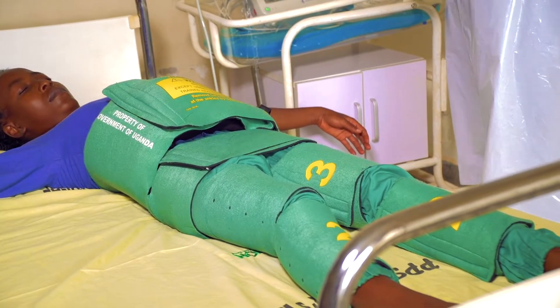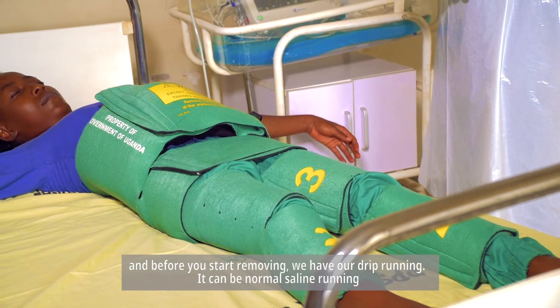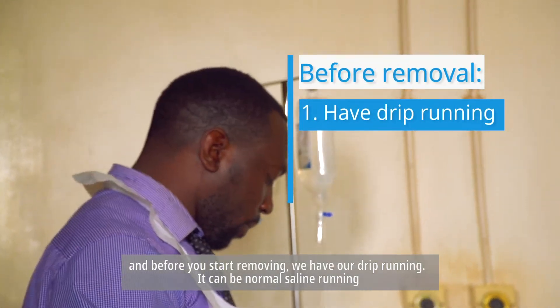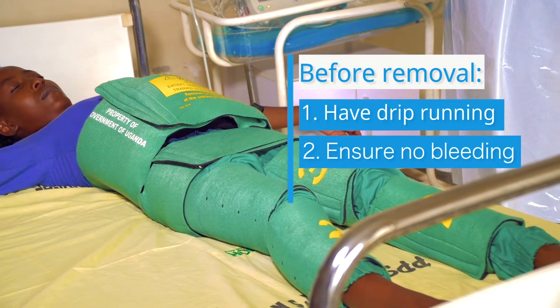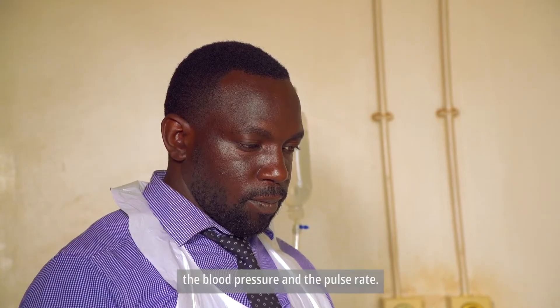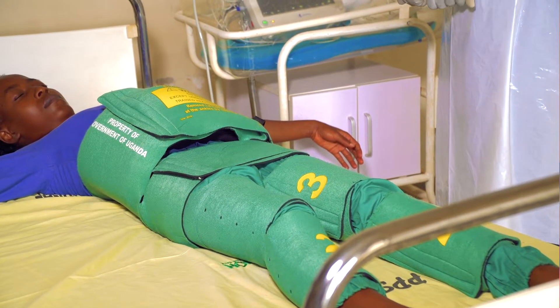Before you start removing, we have our drip running — normal saline — and then you check and ensure there's no more bleeding. Then you take your vitals again: the blood pressure and the pulse rate. Our blood pressure right now is 123 over 87.